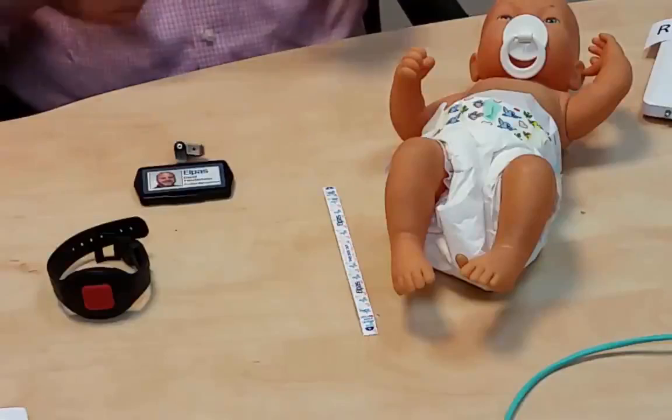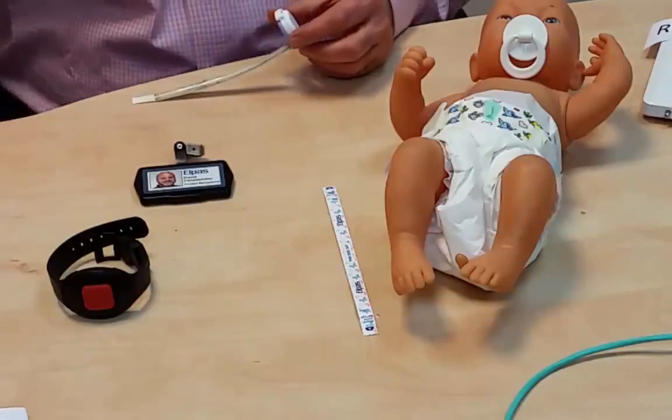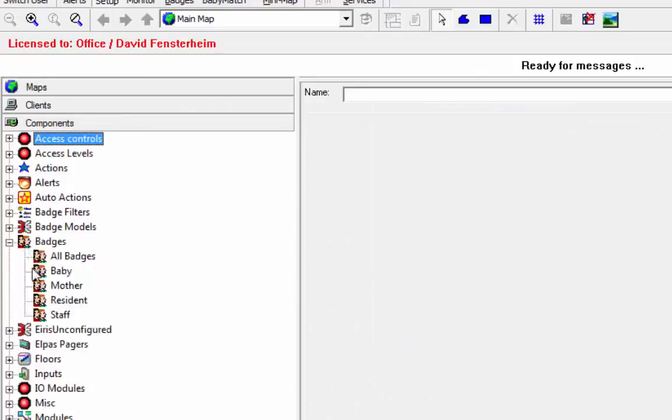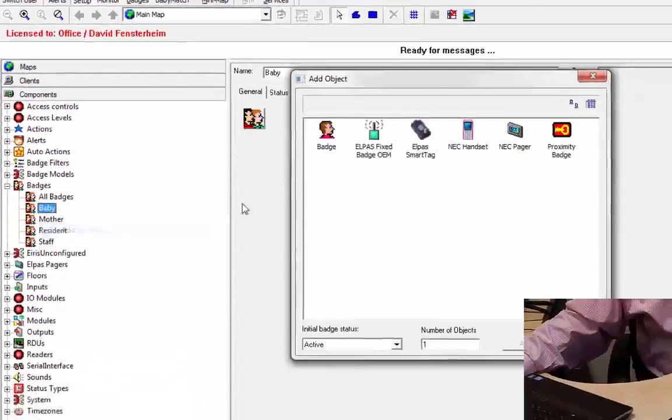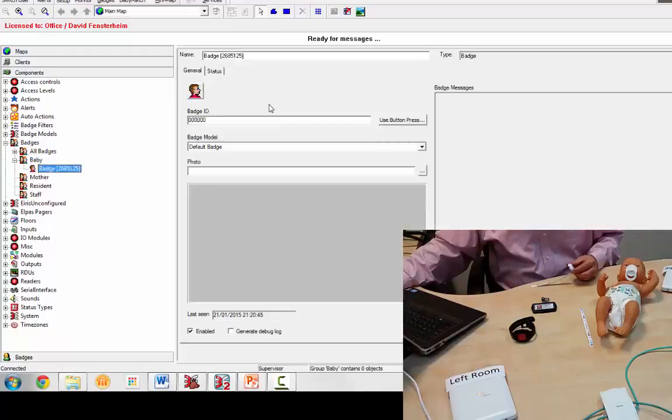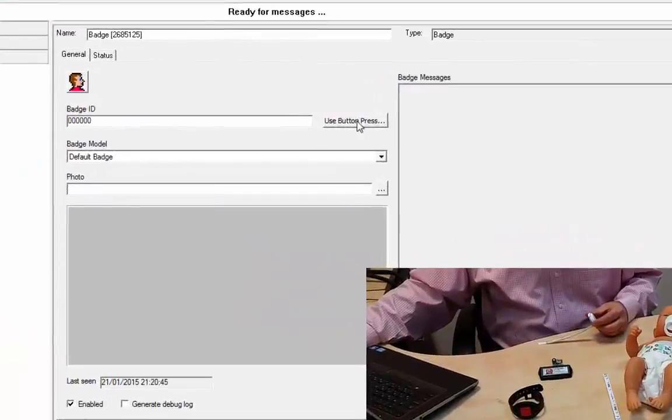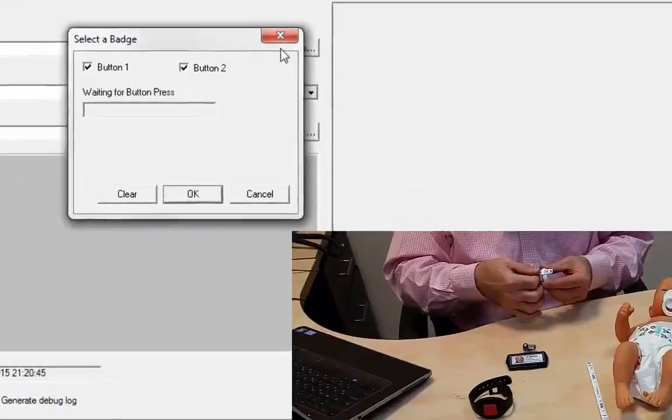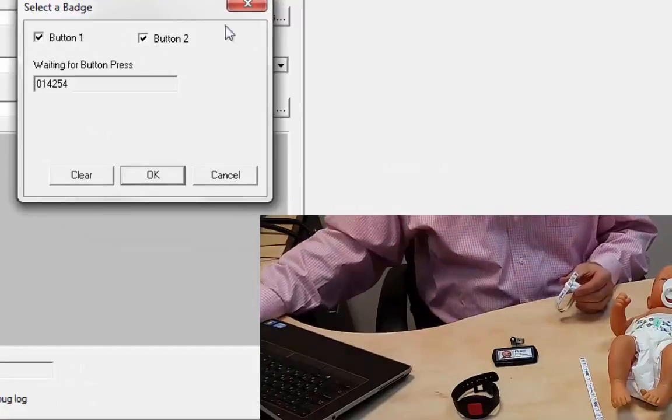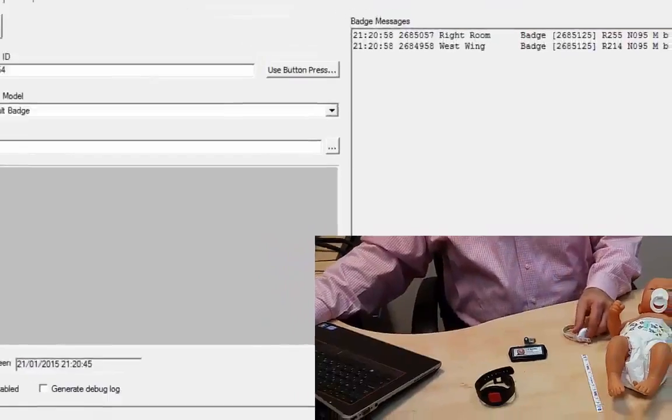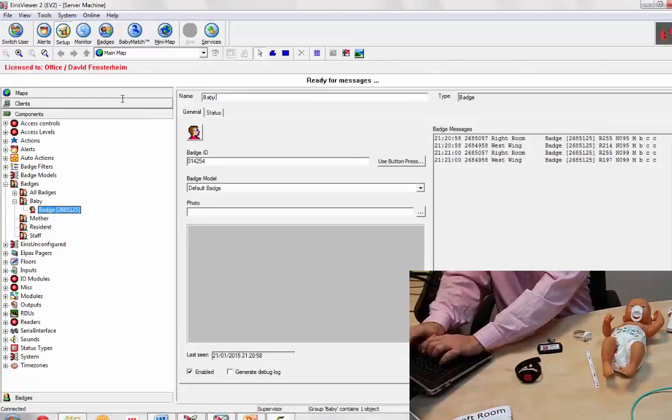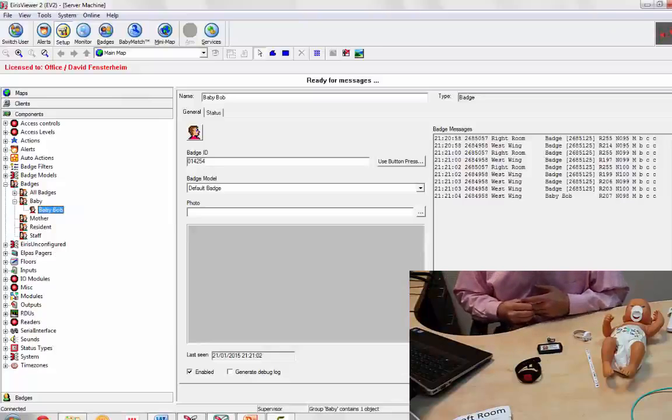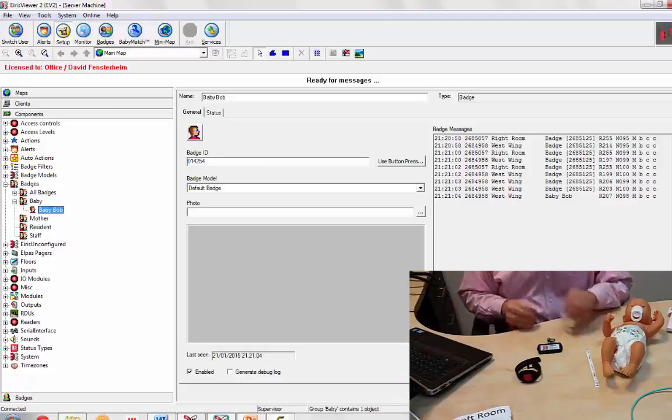Now, we're ready to enroll the tag into IRIS. So let's go to our setup screen, badges, baby add by type, the baby group I added in events, and we're going to use button press. And as soon as we click on that, and we attach the band, we get the button, the ID of the tag. Apply that, give it a name, baby Bob. Again, names are not absolutely necessary in this system.